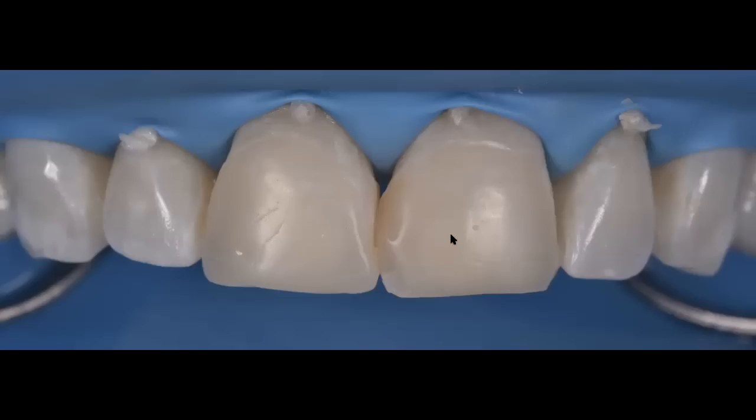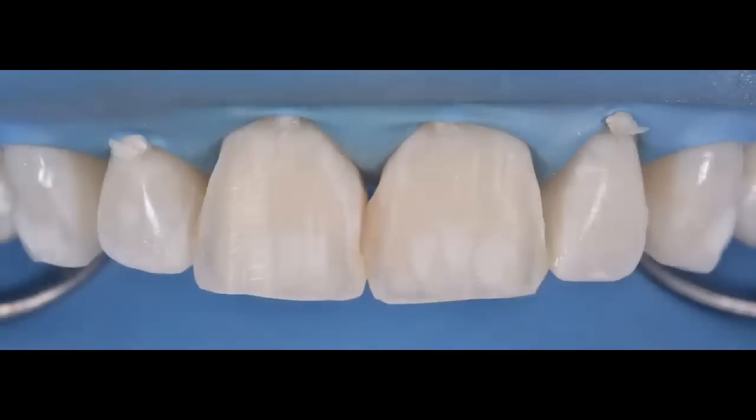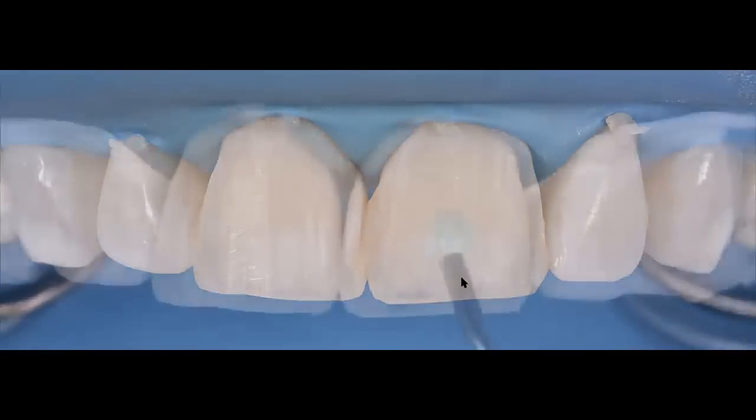So once I did that and I retracted my rubber dam, I went ahead and removed the previous restorations on both 8 and 9. And all I did was just try to eliminate as much composite as I could. There's a little more left here, so I have to use some finishing strips to get into these areas. And I'm just going to remove all that composite to get to nice, solid, and healthy enamel.